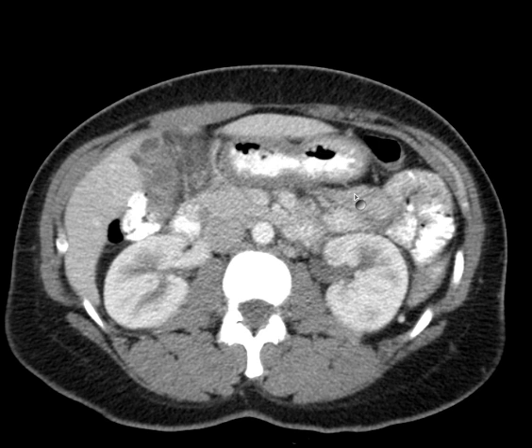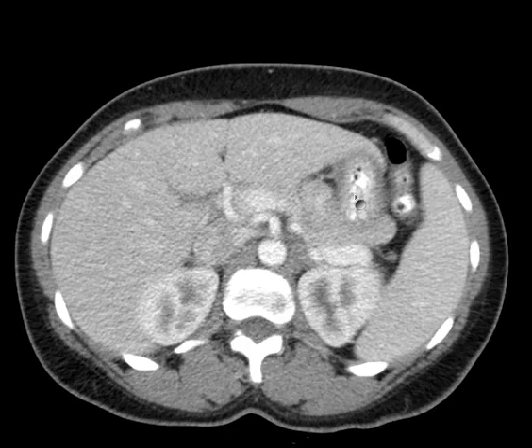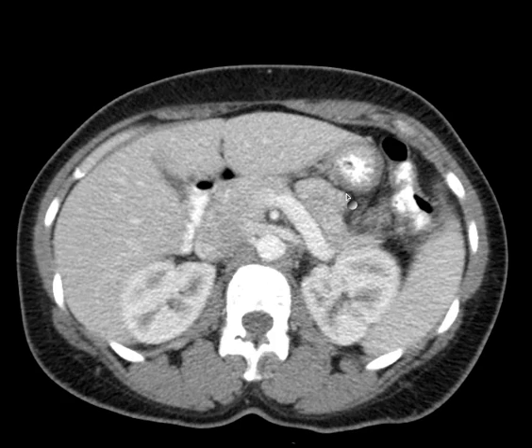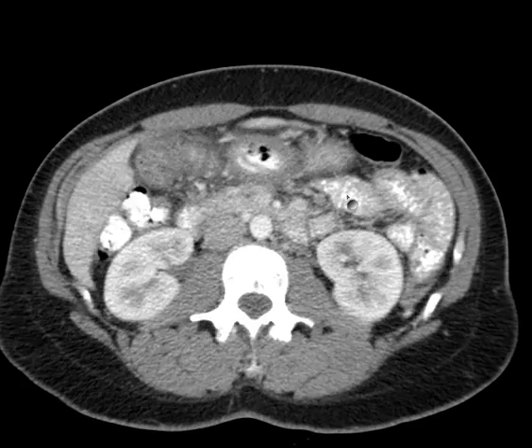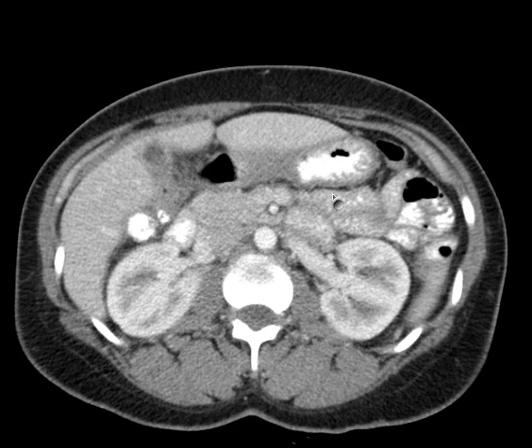Really, that is the realm of the radiologist, and the more you know of it, the better. You should have an idea of one or two likely diagnoses, but identifying an abnormality and describing it, I think, is a useful skill set for a radiologist assistant to have.